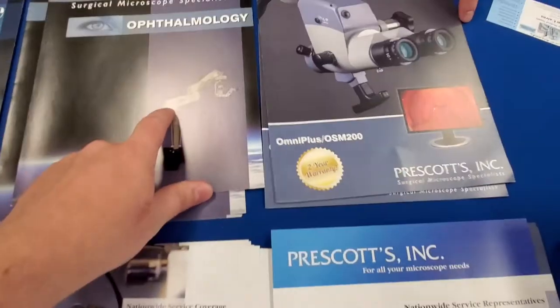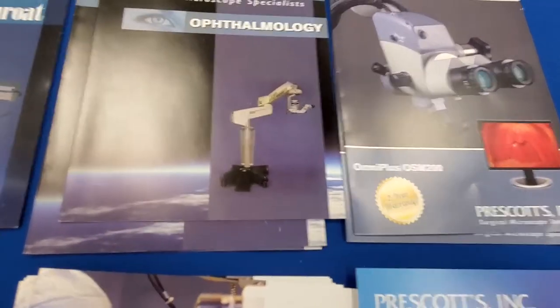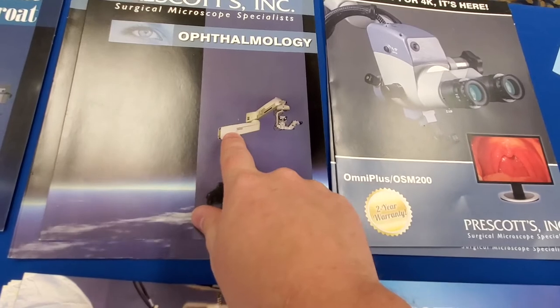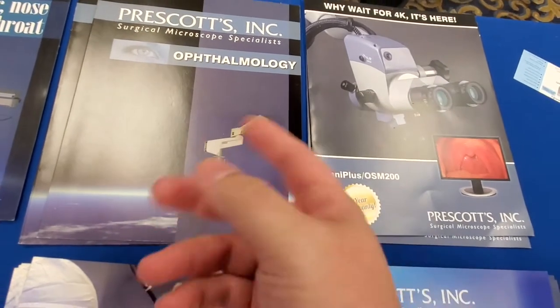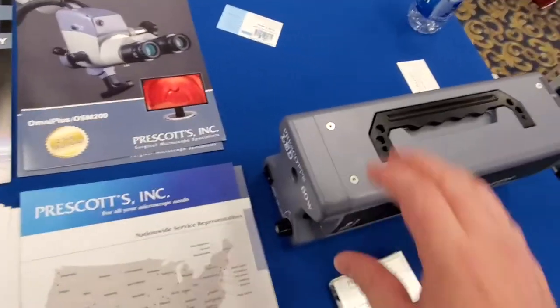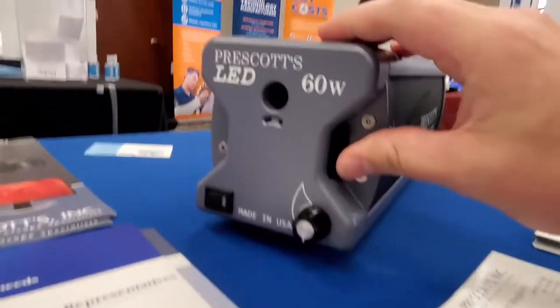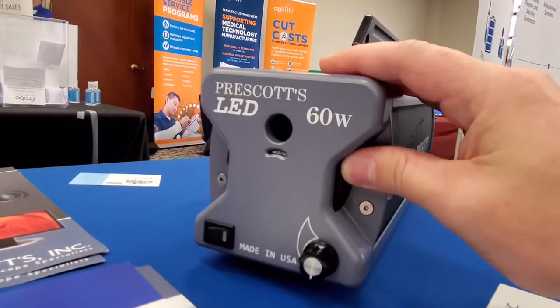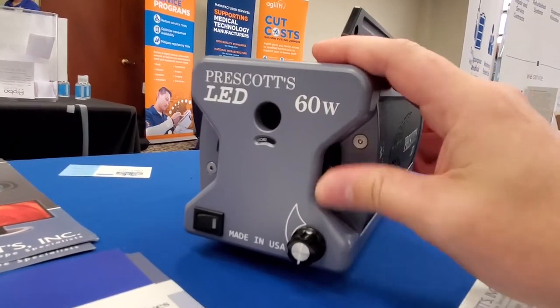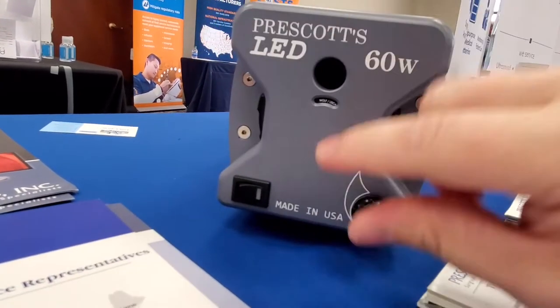For those of you with integrated light sources where the doctor's complaining that the light's flickering too much, or you've got too many repairs because of the bulb holder and how fickle they can be — what we've got here is an all-in-one solution. It has an integrated turret where you can select for your different fiber cables, and that's built right into it.